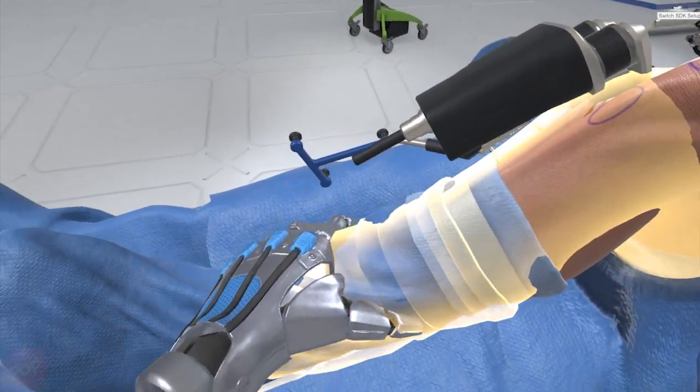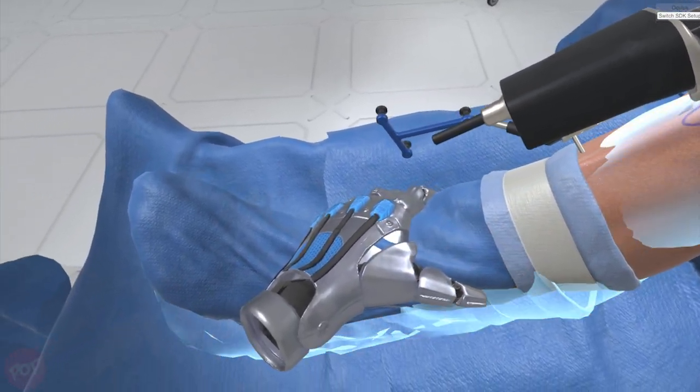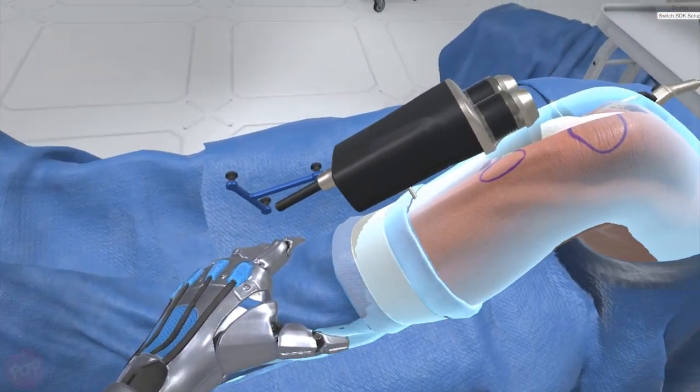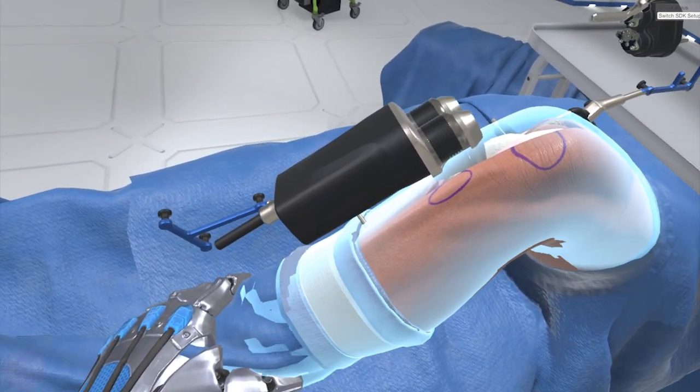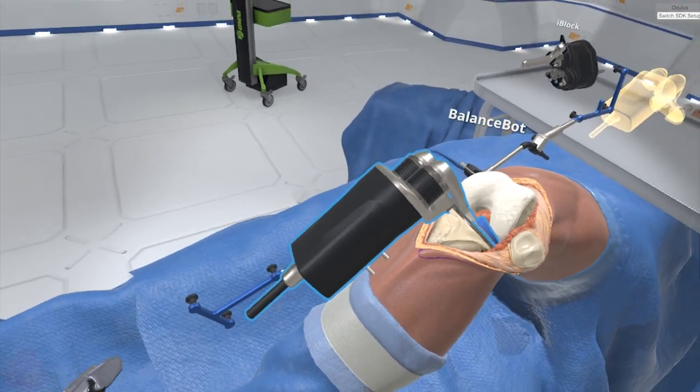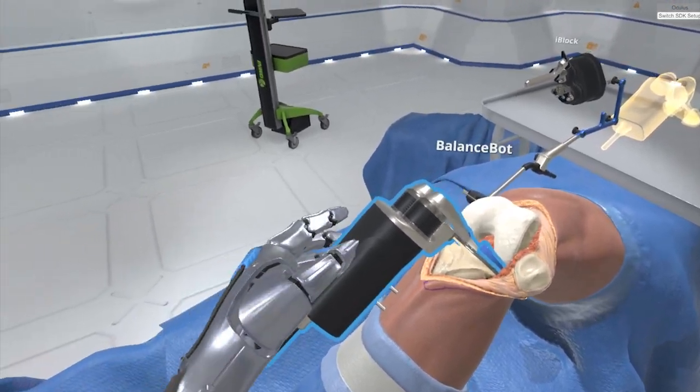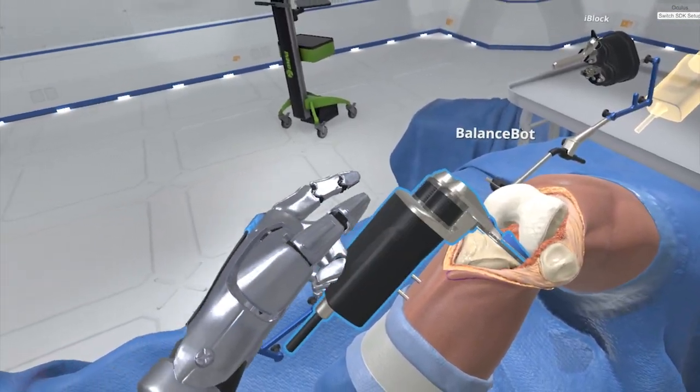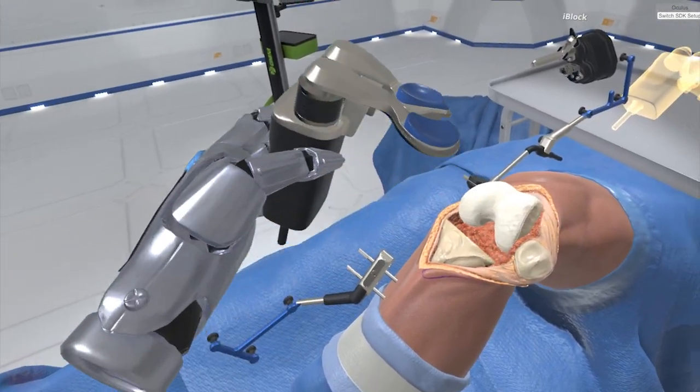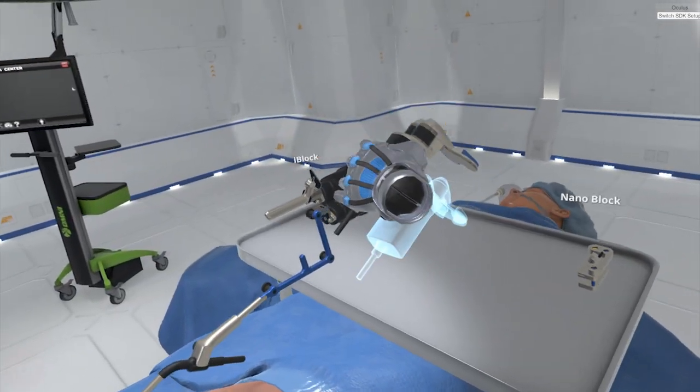When complete data acquisition is achieved, return the knee to 90 degrees. Grab the balance bot and return it to the Mayo stand.